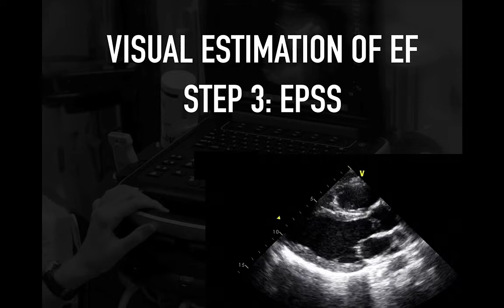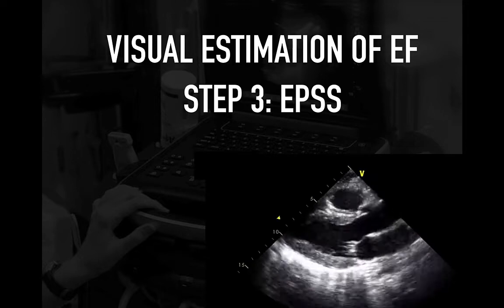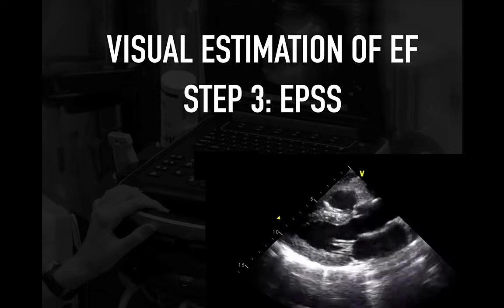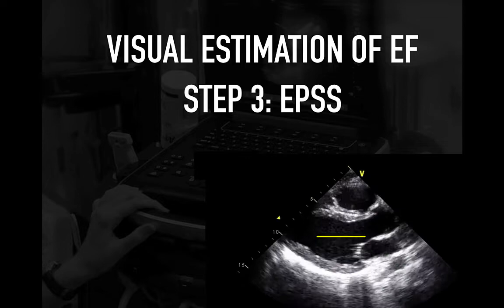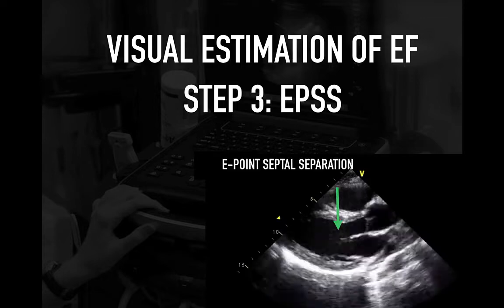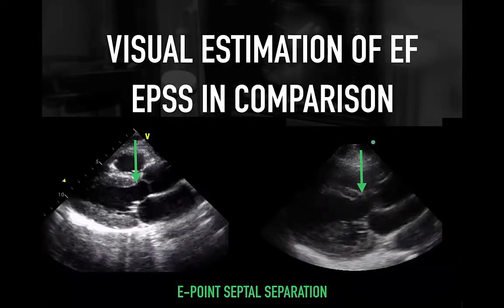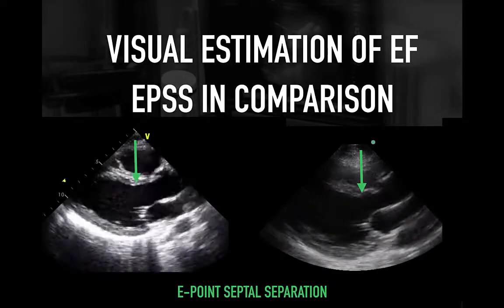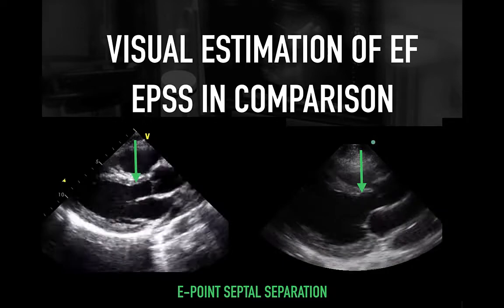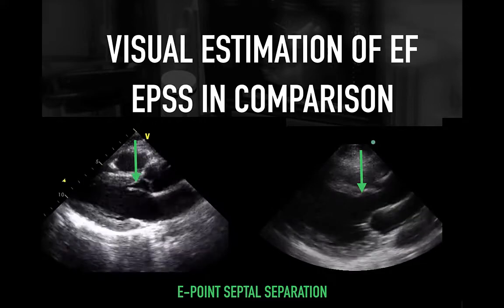Step 3: one of the key measurements in basic critical care echo is the E-point septal separation, or EPSS. This is a term for mitral leaflet excursion, corresponding to the E-wave in diastole — the initial ventricular filling in diastole. Generally, the anterior leaflet will come within one centimeter of the interventricular septum in a normal functioning heart. This green arrow here points out the exact area we're looking at to evaluate the EPSS. There is a major difference in EPSS between a normal heart and a dilated severely depressed heart. If the EPSS is less than one centimeter, it has very high sensitivity to rule out abnormal ejection fraction. The EPSS becomes greater than one centimeter because of changes to transvalvular flow and morphological changes to the ventricle.